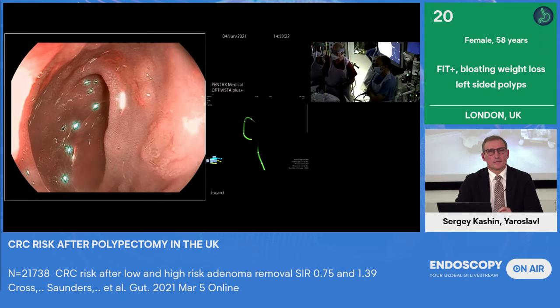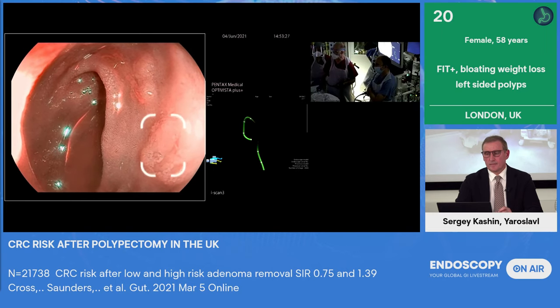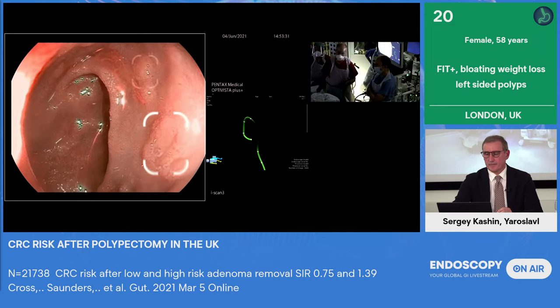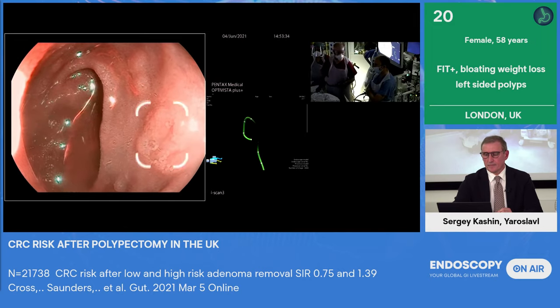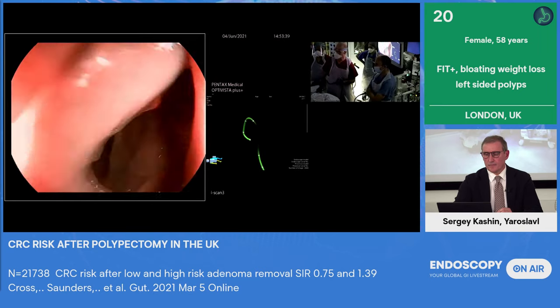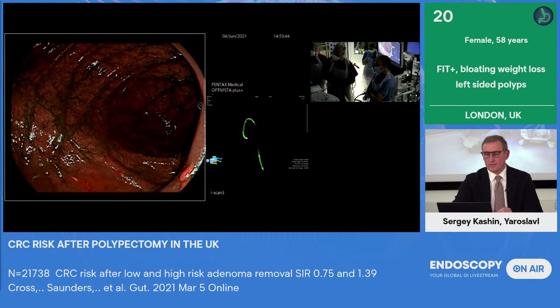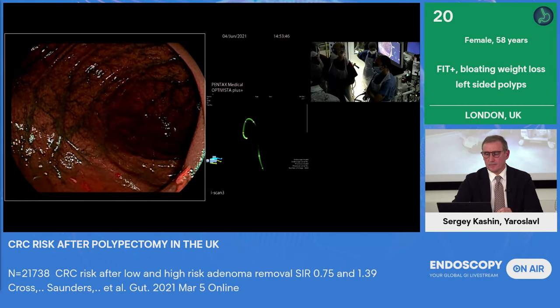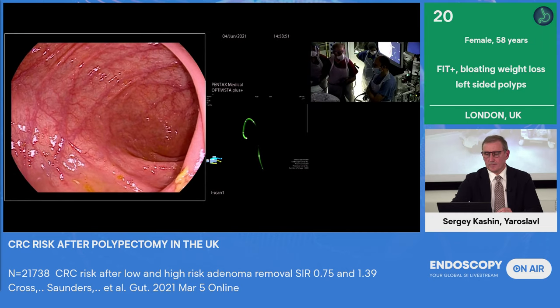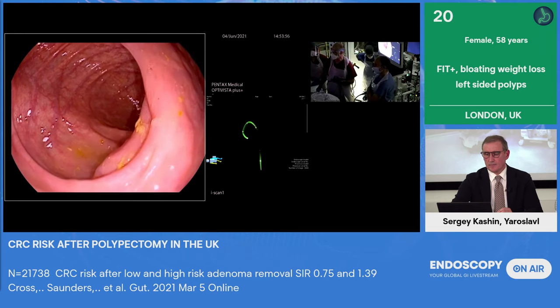The discovery is picking up there. Of course, that's not a polyp. It's a lymph follicle in the terminal ileum. And all the AI systems have quite a high false positive rate. There are eight systems now commercially available. This is an area where I think they have to improve a little bit to give us more in the way of accuracy, because if you get a lot of distraction, that can be an irritation. But of course, they do come into their own when they're picking up polyps.